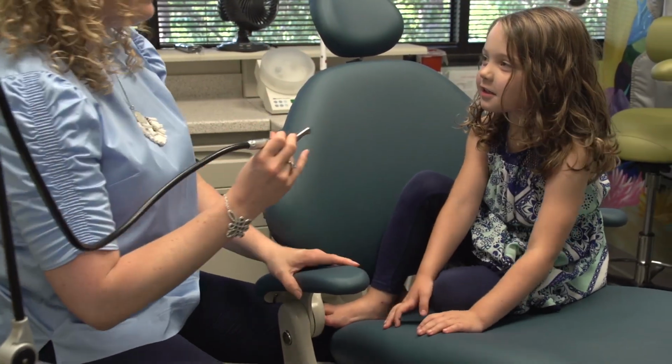So I squirt their tooth with this awesome laser energy. What it feels like, I tell them, is just water. And we always show it to the kids beforehand, and we call it our airplane. Because on the settings that we use to get your teeth nice and numb, it sounds like a drone. Sounds like, and that kind of starts the process of taking away the decay.